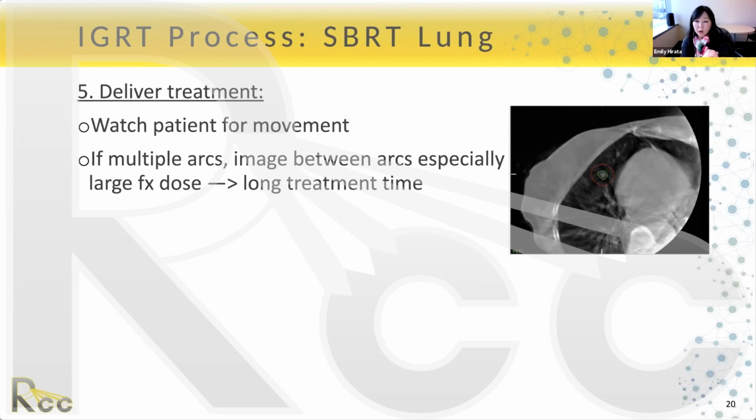So this can be a lot of imaging time. And again, your treatment time is going to be long, but it is important to get comfortable and understand the treatments that you're doing. We do verification scans after shifting, and especially if it's a single dose extracranial SBRT, we absolutely will image between arcs to confirm that the patient hasn't moved.